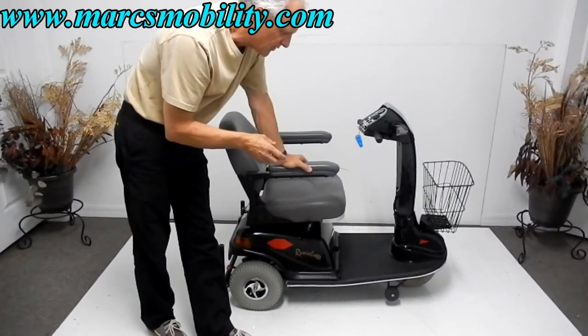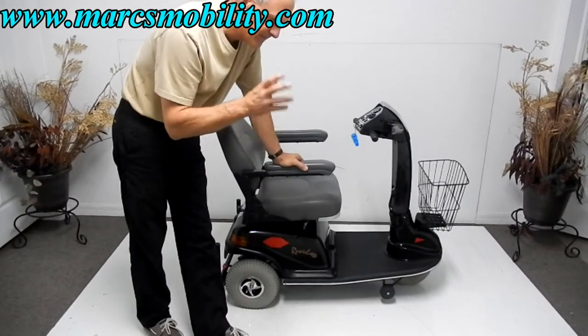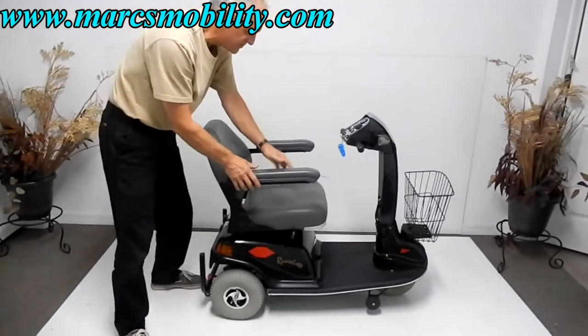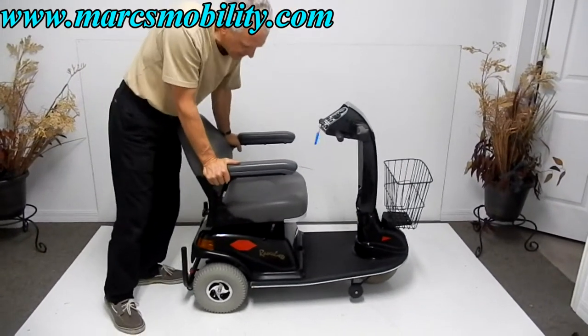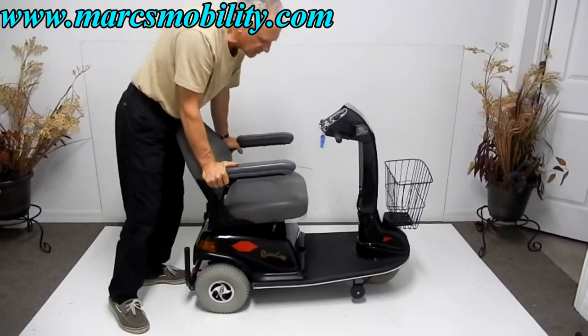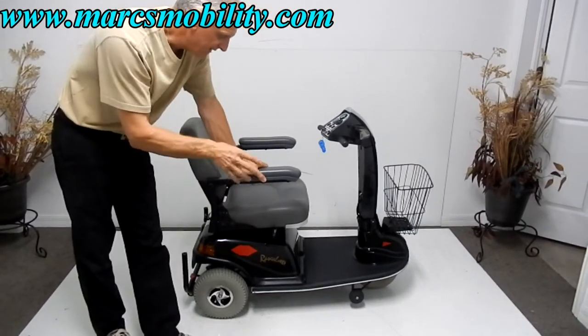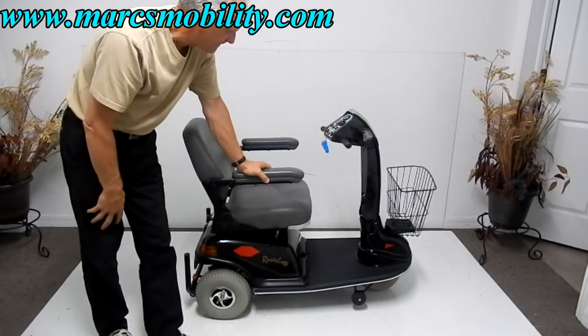This scooter is the only one from this company that has springs on the back. It also has a leaf suspension. You can see the suspension here — it's got springs and a leaf suspension on both sides of the transaxle.